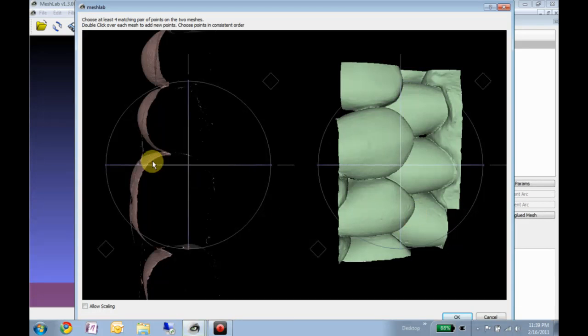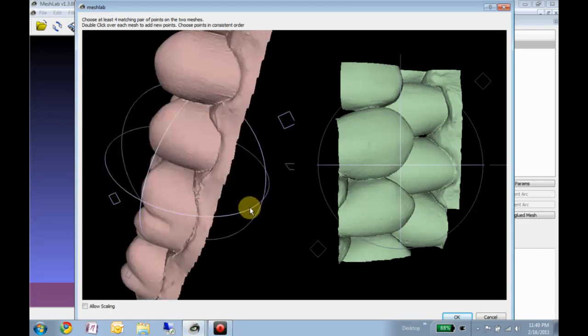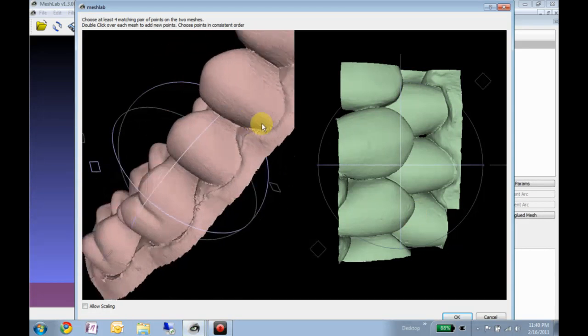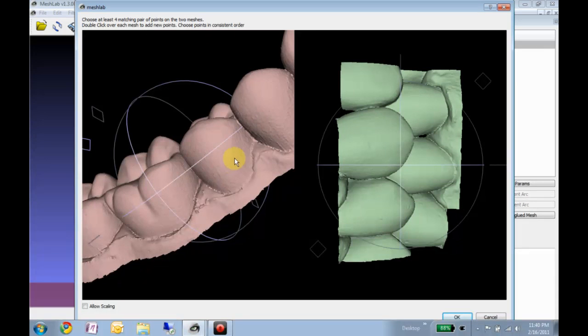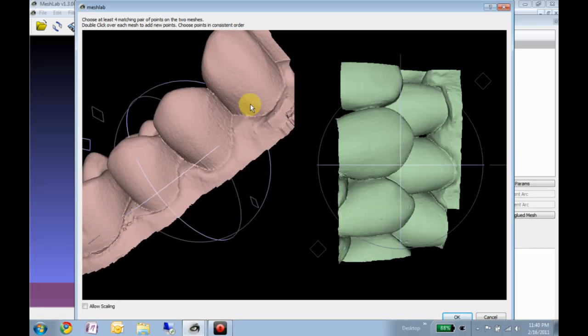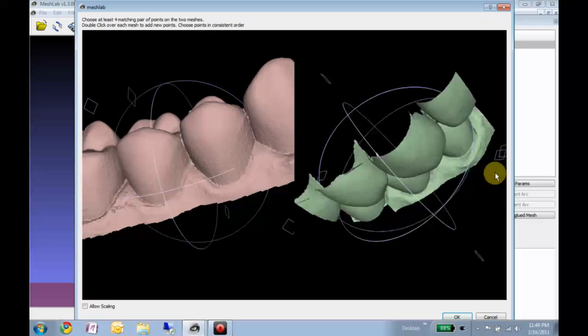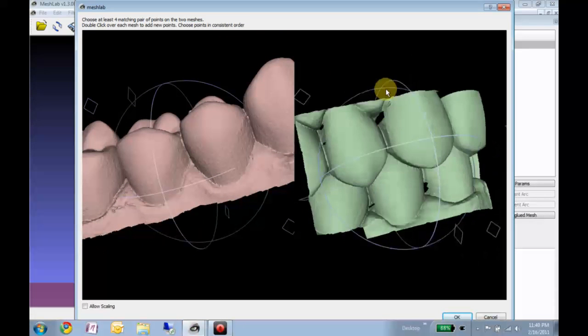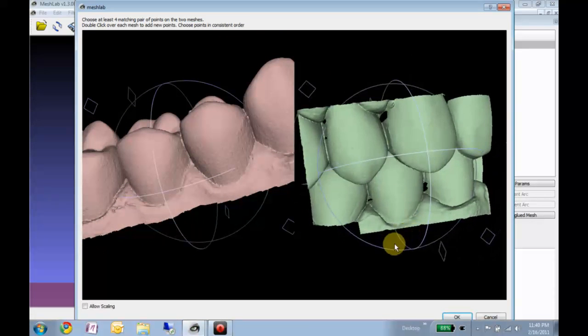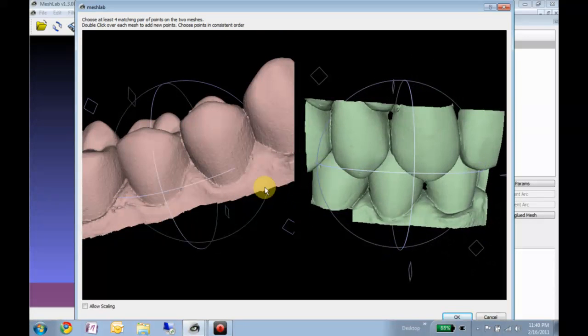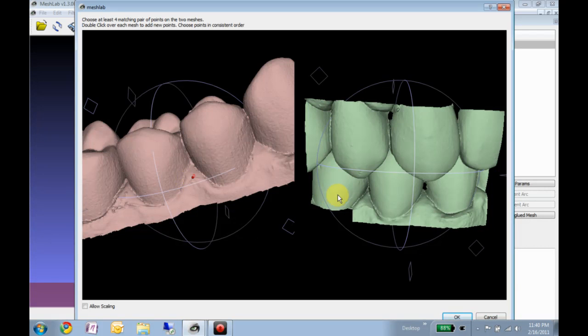And so we'll use point-based gluing, essentially tell it three or four points that are corresponding on each mesh.